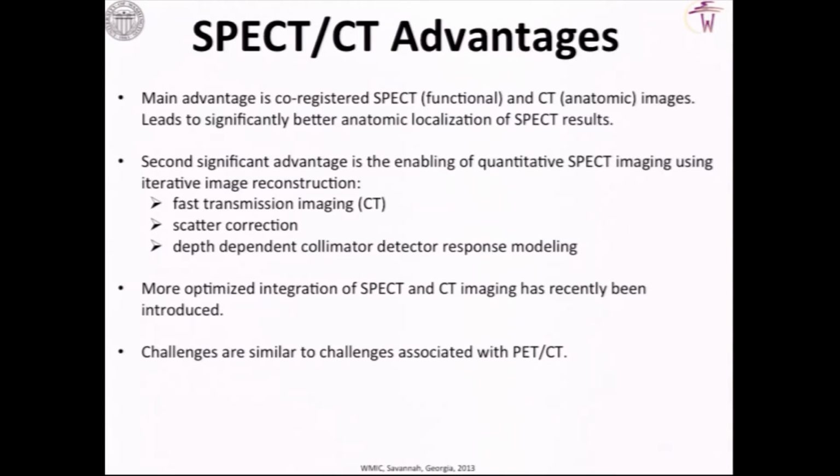And the main reason is attenuation correction, as Roger talked about earlier today. In SPECT, it is depth dependent, whereas in PET, the attenuation is not dependent upon where the event occurred on the line of response. And because of that depth dependent attenuation, you can't just use simple filtered back projection to make the attenuation corrections. And so it's been a little bit more complicated.